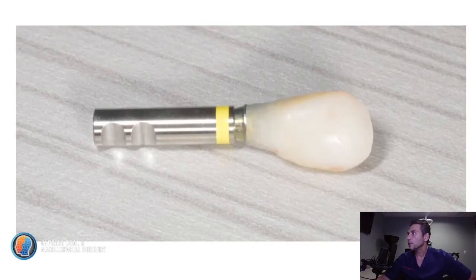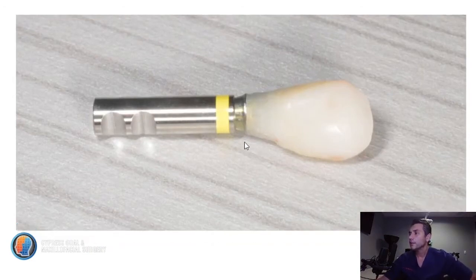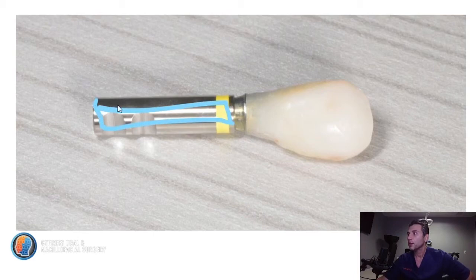First step is we actually take the temporary out of the mouth. That's number one. Number two, this is an implant analog, and we screw the temporary into the analog. Now, one thing I want you to be very careful with: when you screw them in, don't make them very tight, because otherwise a lot of times when you try to unscrew them, the analog will spin in the impression, and I'll show you what I mean by that.